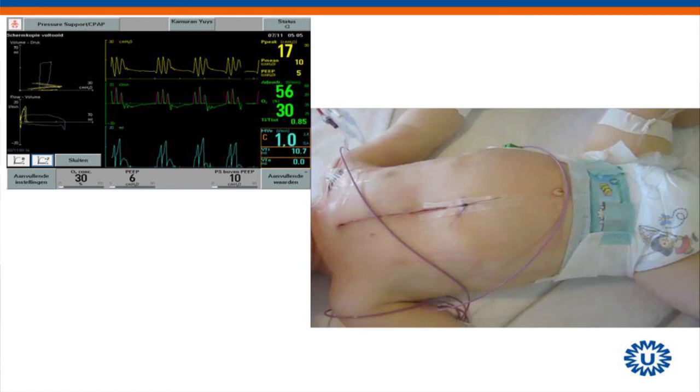Better? That's it. What you see is enormous frequency. You trigger, trigger, trigger, trigger. Could it be auto-triggering?